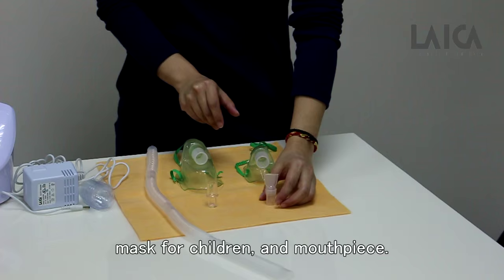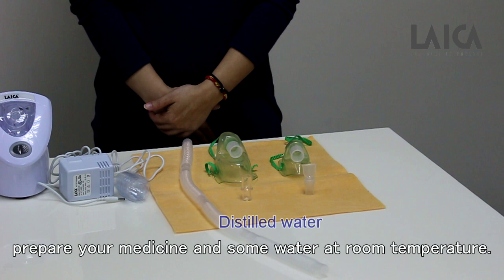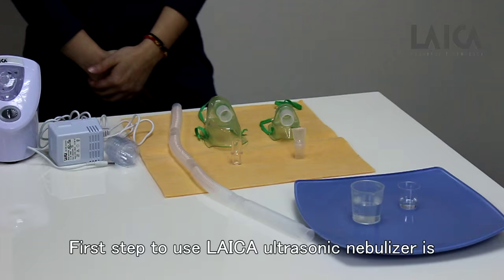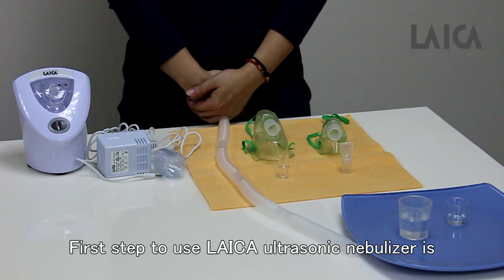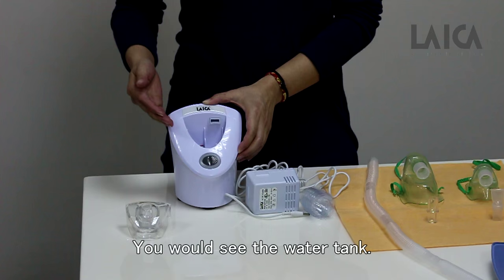Before using LAICA ultrasonic nebulizer, prepare your medicine and some water at room temperature. First step to use LAICA ultrasonic nebulizer is to hold the main unit and remove the cover. You will see the water tank.